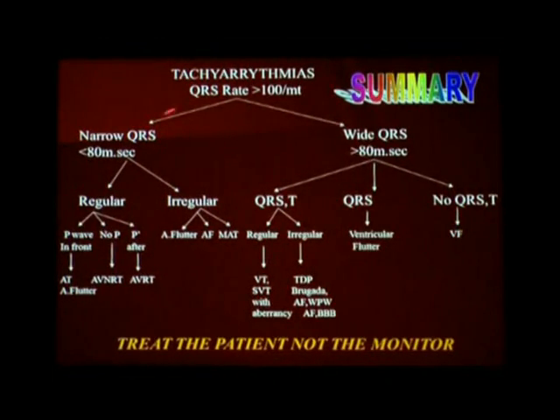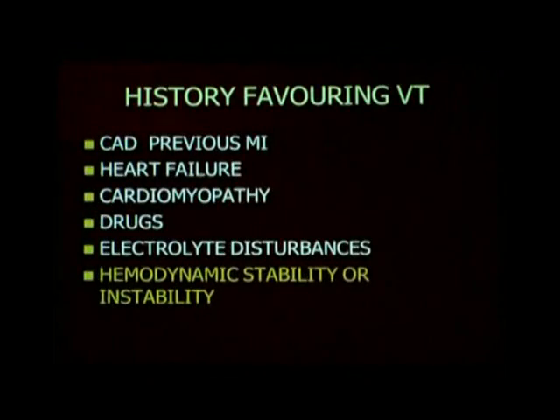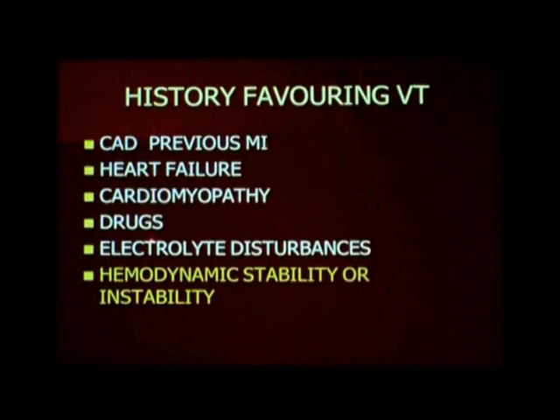So this is an approach to the entire tachyarrhythmia, wide QRS tachycardia and narrow QRS complex tachycardia, that differential diagnosis and so on. So these are the clinical pointers to decide whether the wide QRS complex tachycardia is ventricular tachycardia or SVT with aberrancy.